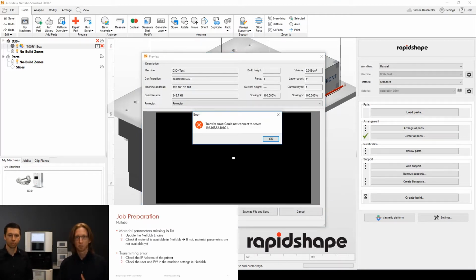As you can see, we have a transfer error. This could happen from time to time at the customer side. Yes, we have seen this quite a lot. The first obvious reason for the transmitting error would be the IP address. What we can see here is that it ends with 101, 21. 21 is just the port number, so don't be confused by that. The IP address ends with 101 here, and let's just see if this information is correct.